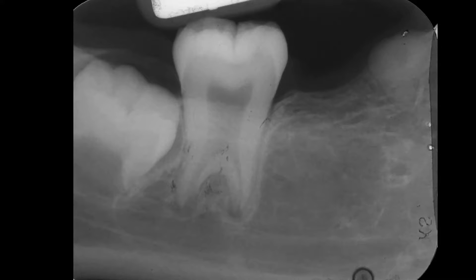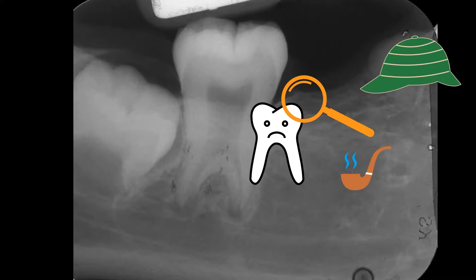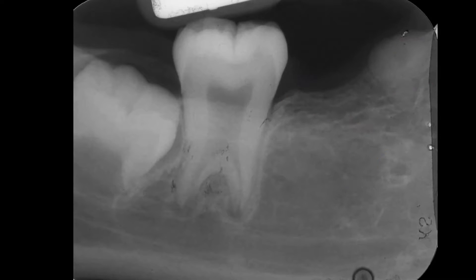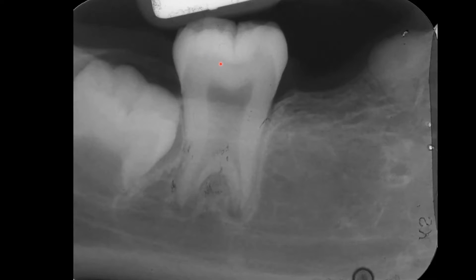When you read a radiograph, it seems that you are being a detective. This sad looking tooth must have left a lot of clues for us to make a diagnosis. Let's compare this crown to the incompletely formed crown. The size of these two teeth are similar. The striking finding is in the root — the bifurcation is almost at the apical third.